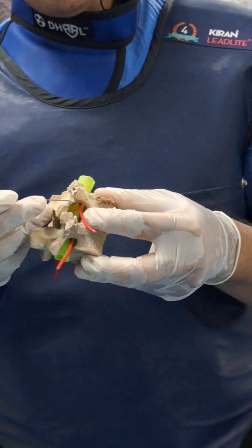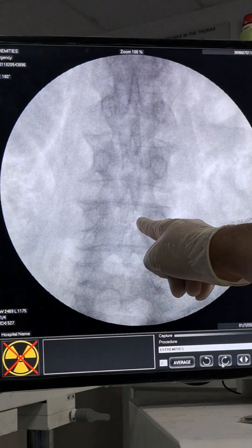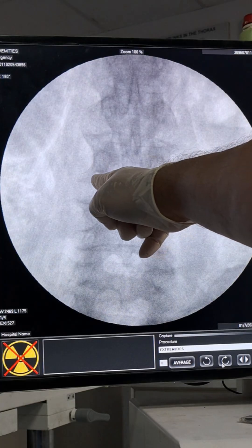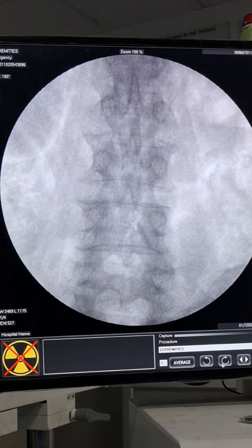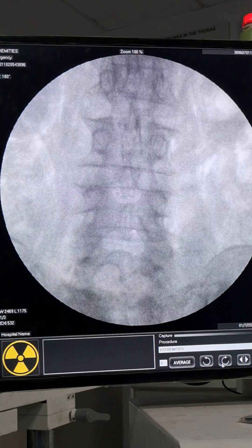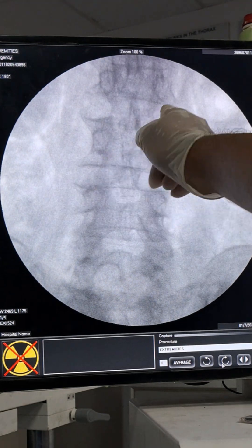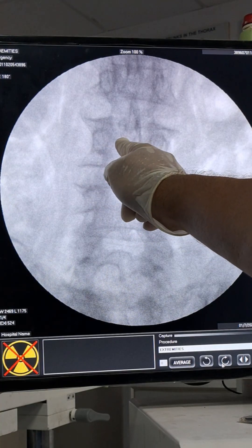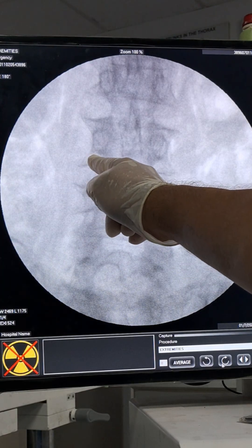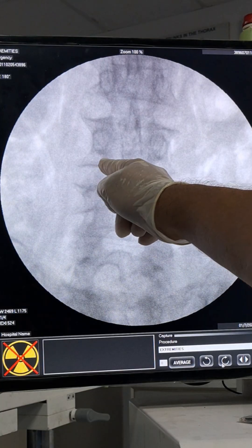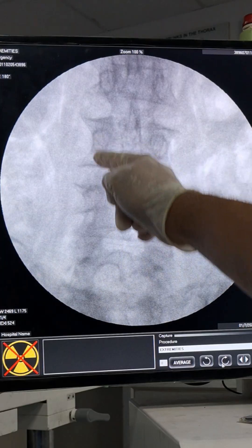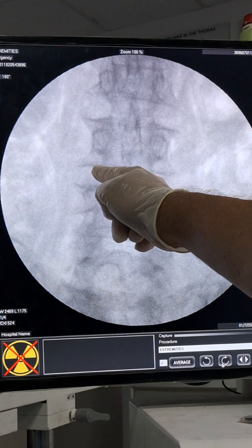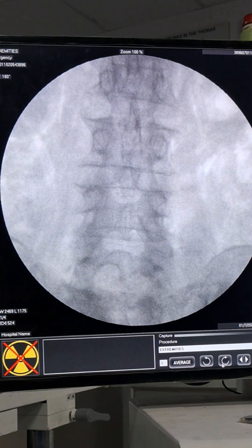Now I will show under fluoroscopy how it is done. We can see L5, L4, and L3. I am going for L3 dorsal root ganglion RF on the left side. First I will do squaring of L3. Now L3 is squared. This is the pedicle, this is the pars, here is the foramen, and the root is coming this way. The target will be at a slightly higher level because the subpedicular triangle is smaller than Kambin's triangle — it is not exactly at half, it is a little up.